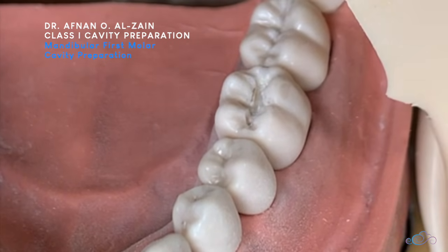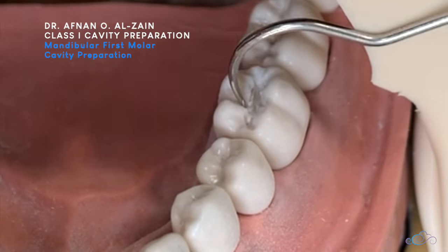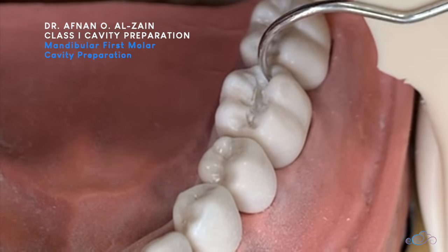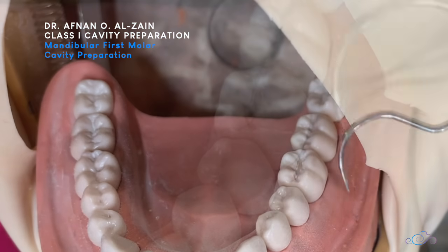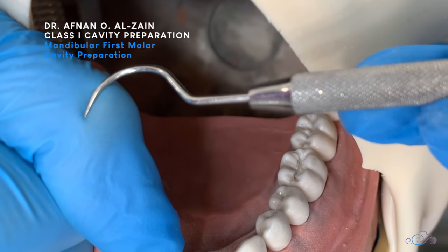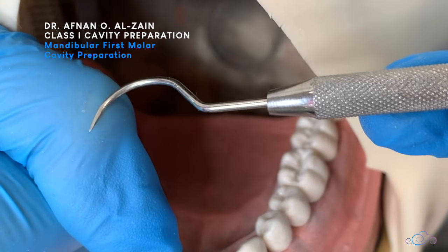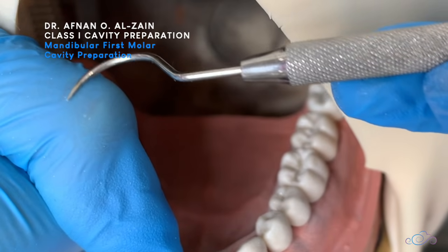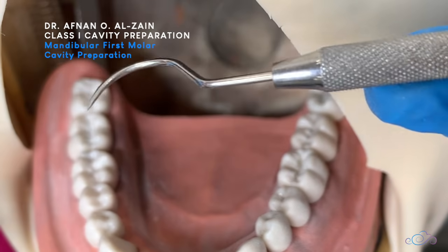We're finishing the floors, making sure that there are no catches and no ledges. We're going to brush with the handpiece gently — we're not going to press on the floor, just gentle brushing strokes. We don't want to increase the depth, but we want to remove any excess.